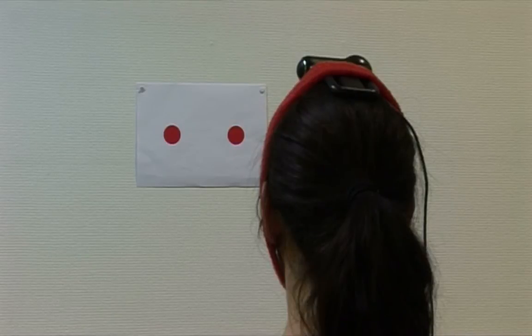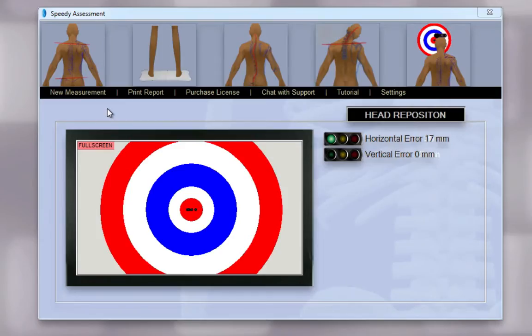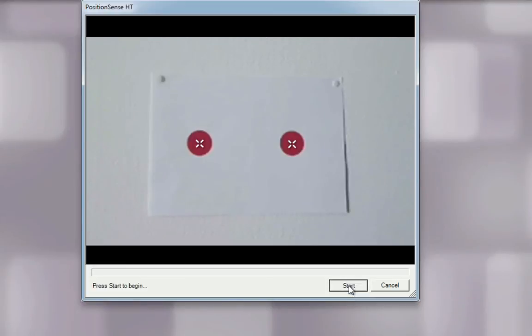Now click OK. Have the patient blindfolded or with their eyes closed. You are now ready to perform the test — click on New measurement, then click on Start.